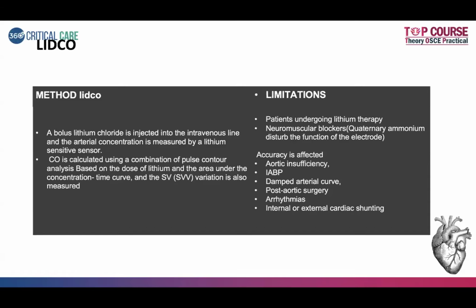Then it gives us the cardiac output. The limitations would be patients who are undergoing lithium therapy or receiving any neuromuscular blocker which has a quaternary ammonium component, which could disturb the function of the electrode. Other problems which could affect the reading in LiDCO are aortic insufficiency, IABP, damped arterial wave, post-aortic surgery, arrhythmias or shunting problems.